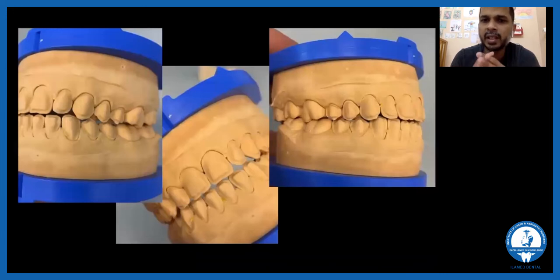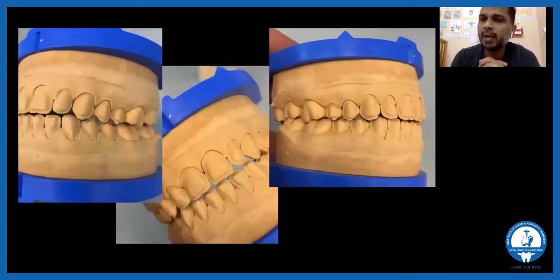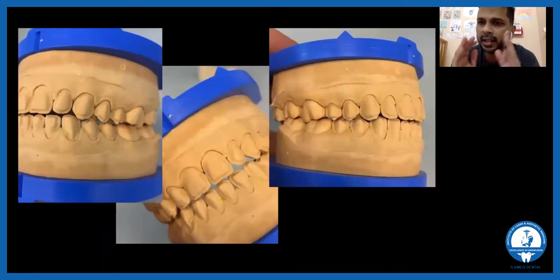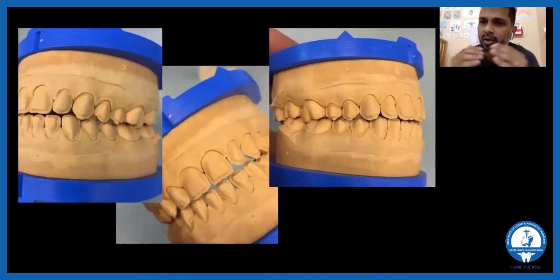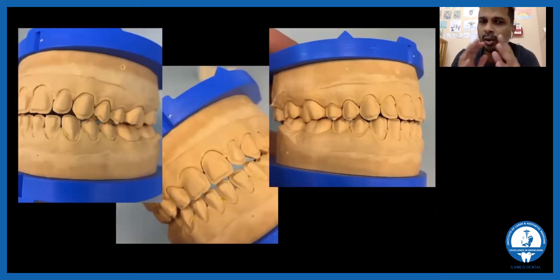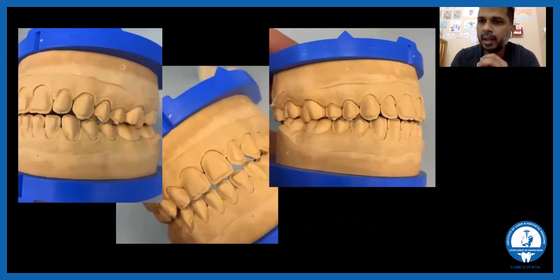When doing multiple veneers extending till the premolar, we try to do all feather or window preparations without touching the incisal edge, because we do not want to break the natural contact of the upper and lower teeth.